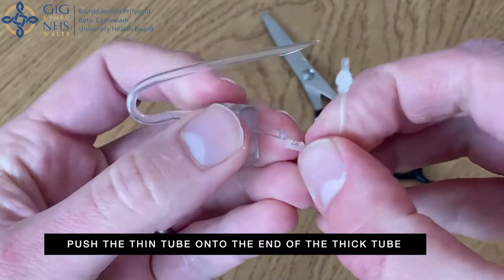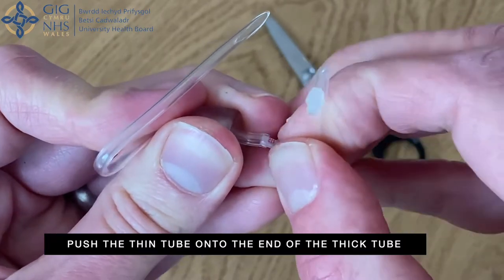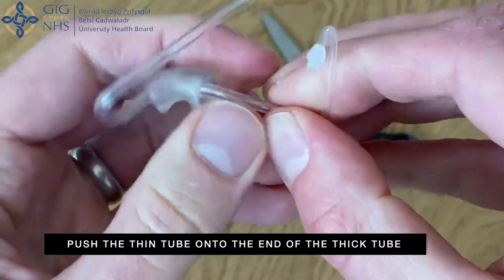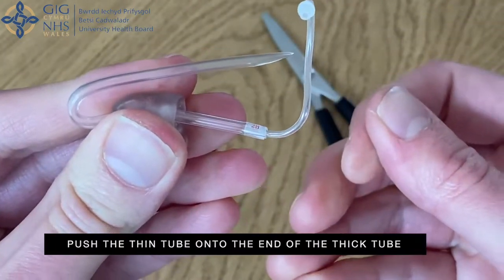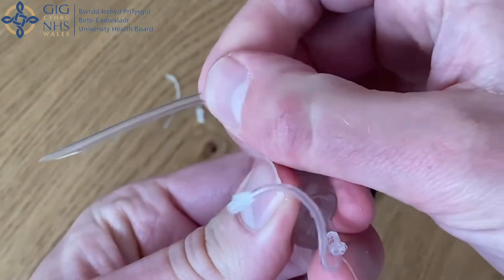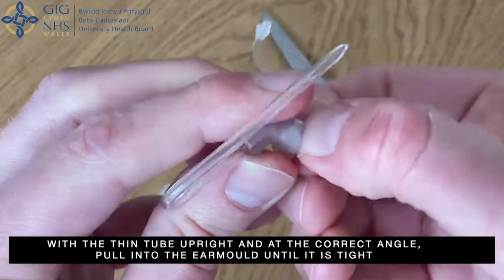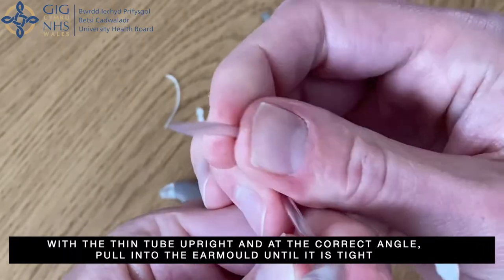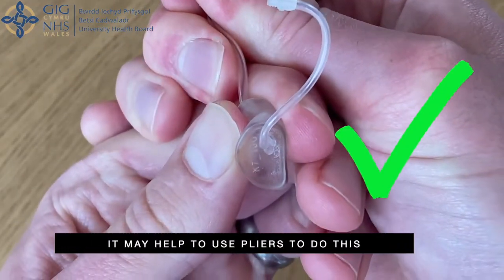Push the new thin tube onto the end of the thick tube. With the thin tube upright and at the correct angle, pull the thin tube into the ear mould until it is tight. It may help to use pliers to do this.